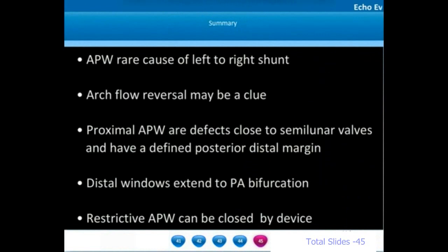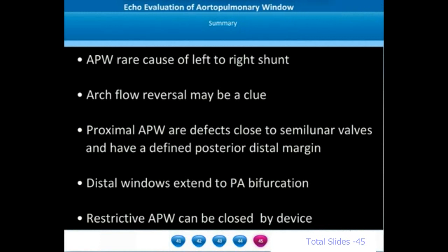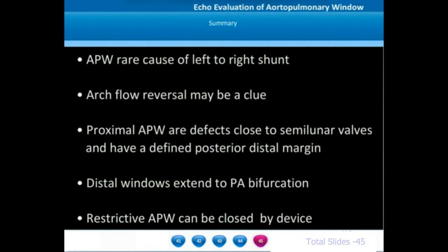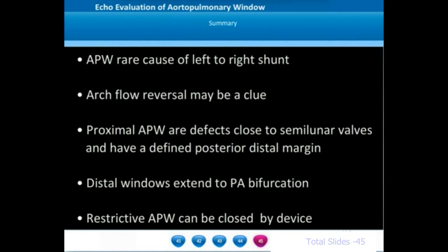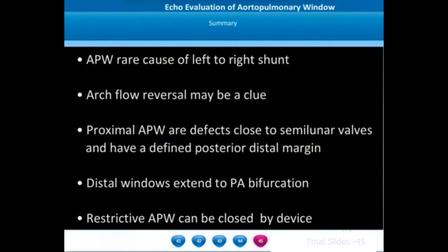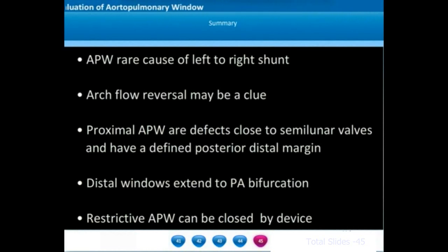To summarize: aortopulmonary window is a rare cause of left-to-right shunt, with frequency much lower than ventricular septal defect, atrial septal defect, and PDA. Flow reversal in the arch may be a clue to pick up an aortopulmonary window. Proximal aortopulmonary windows are defects close to the semilunar valves with a well-defined posterior distal margin that do not extend up to the pulmonary artery bifurcation. Distal AP windows extend up to the pulmonary artery bifurcation and in most cases the right pulmonary artery arises from the posterior wall of the ascending aorta. Very rare restrictive AP windows can be closed by transcatheter methods.